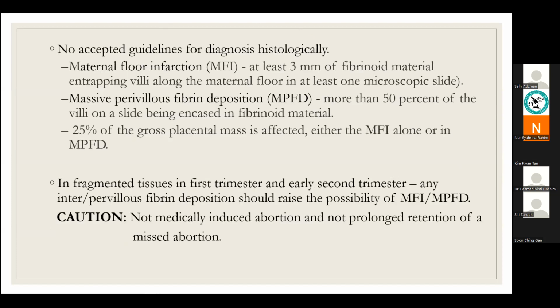So actually, there are no accepted guidelines for histological diagnosis. There are a few, so I just take a few criteria that I'm quite comfortable using. If I want to say maternal floor infarction, there will be 3 mm of fibrinoid material entrapping villi along the maternal floor in at least one microscopic slide.